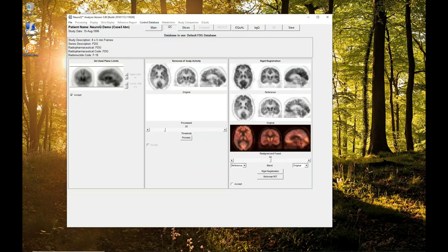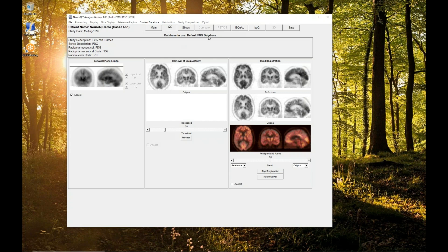That's the normal files. There's a little bit of information that we extract from the file to help you in case the site is not sure what it is. The series description, radiopharmaceutical, and that kind of thing, just so that they can double check that with the normal file that it's currently using.